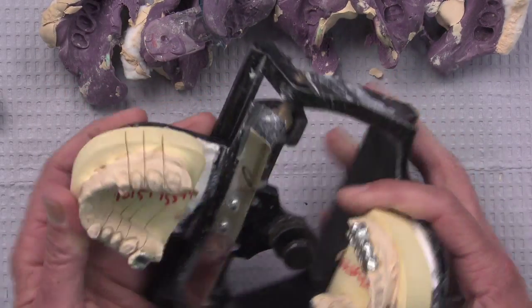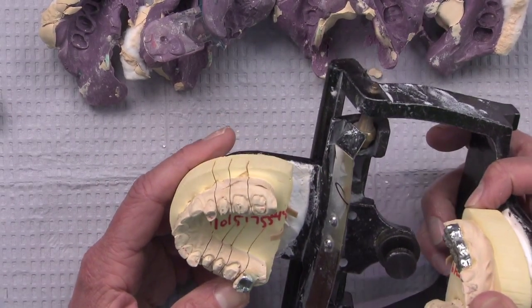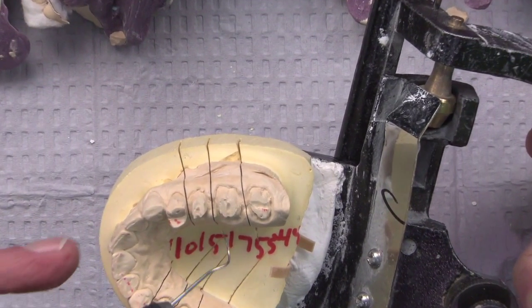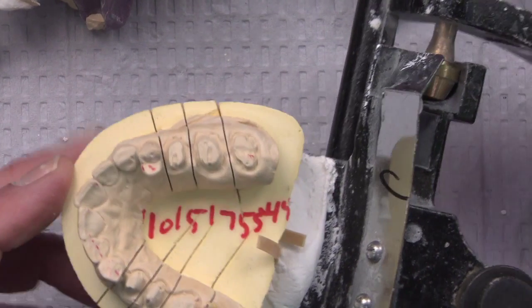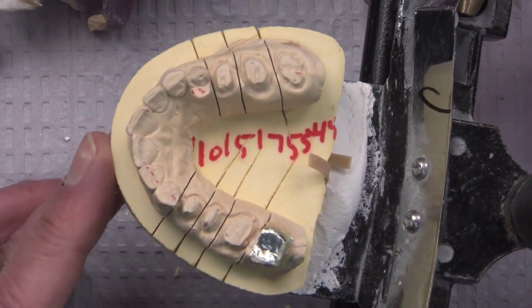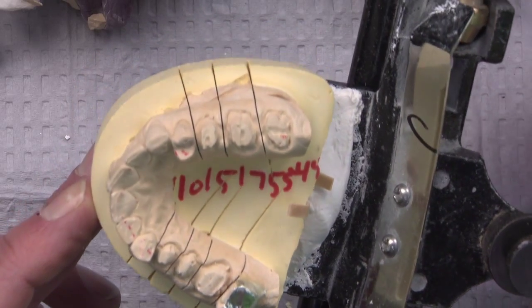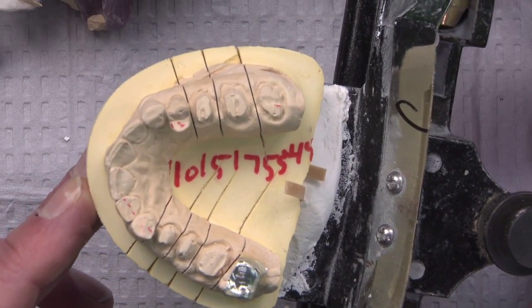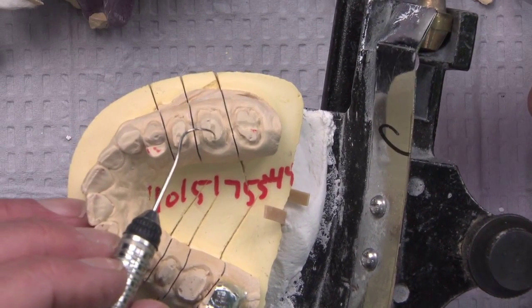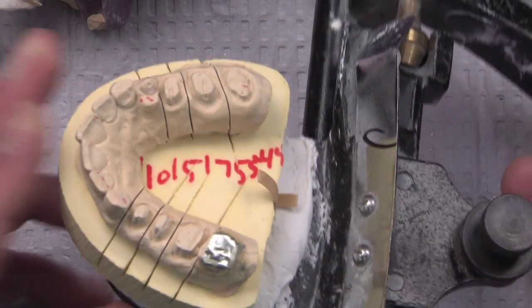So now let's take a look at some of the preparations here, since we've seen the impressions, and see if we see any signs of tissue retraction. You can see some signs of where we went in and tried to trim stuff, looking for some of the margins. That's a burr mark. But when we're looking, or even over on this side, for signs of retraction, signs of a wide open sulcus where we could get material beyond the margin, we don't see a lot of that. And by the way, these marks, I'm sure you know as well as I do what those are from. Those are from removing the old crowns that were in place.